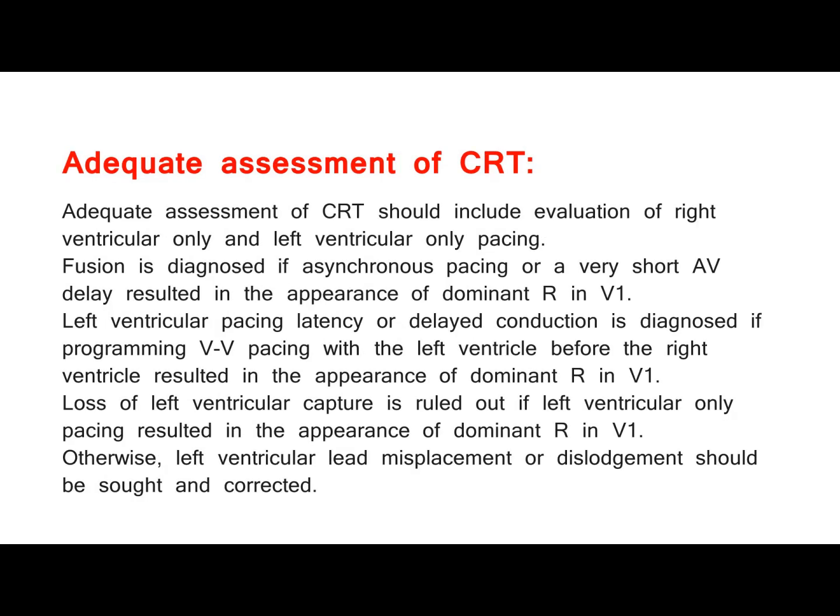Adequate assessment of CRT should include evaluation of right ventricular only and left ventricular only pacing. Fusion is diagnosed if asynchronous pacing or a very short AV delay resulted in the appearance of dominant R in V1. Left ventricular pacing latency or delayed conduction is diagnosed if programming VV pacing with the left ventricle before the right ventricle resulted in the appearance of dominant R in V1.